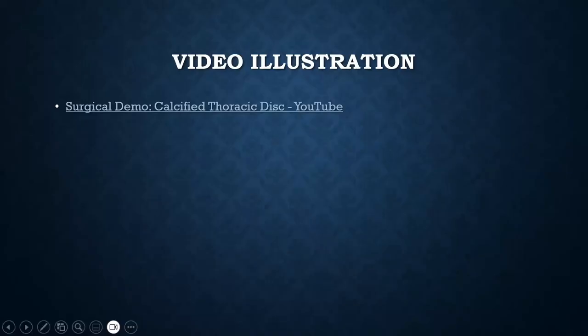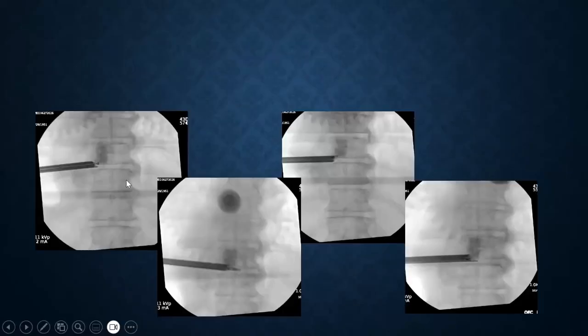So now you've debulked it. You could take some x-rays to check that you got what you're looking for. So you could see in this first picture here, this is a drill. We're on the lateral extent there. That's where we're starting to drill our trough into the bone to create a little opening to flick the disc into. The second picture shows our Hartmann or pituitary across midline. And we know this is a midline disc. So once you cross the midline, then you know that you're good.